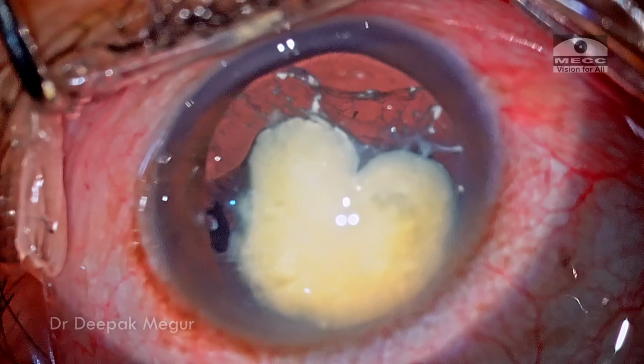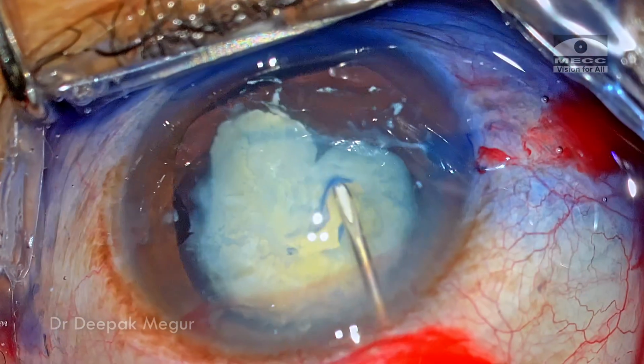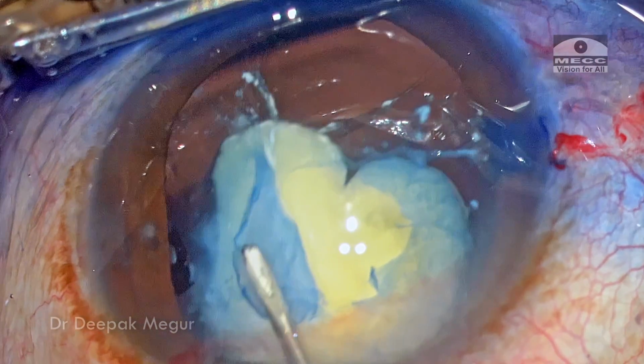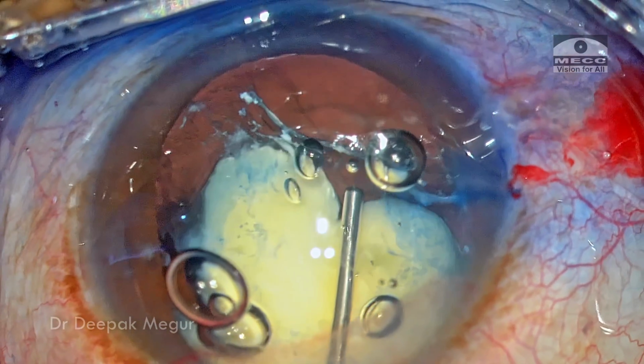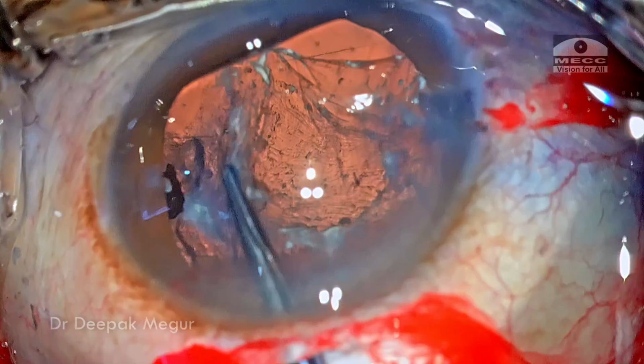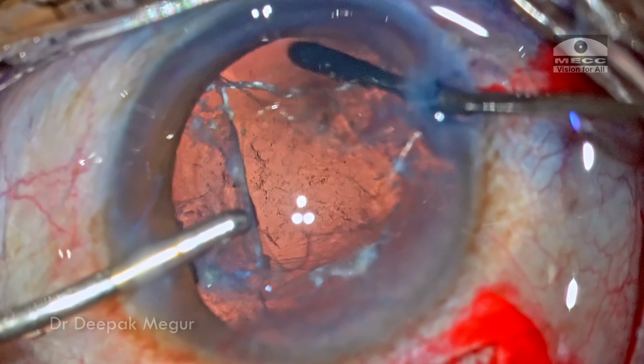Hi, this is Dr. Deepak Megur, and today I'll be taking you through a very complex and challenging case. But these are the cases which actually give us a kick to think, plan and do surgeries. These are the exciting cases which really wake the surgeon in us and make us think. And let's see how this case turns out.